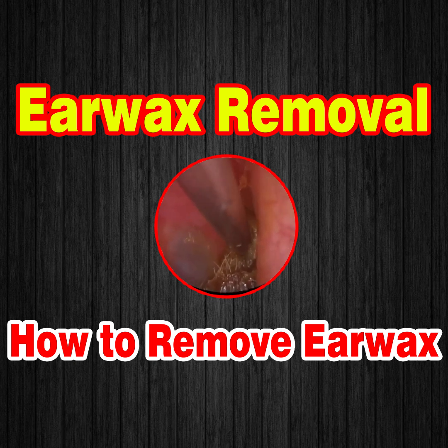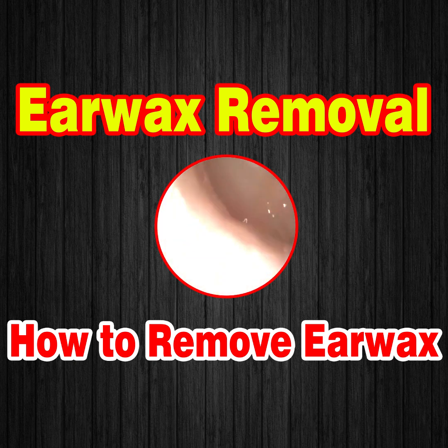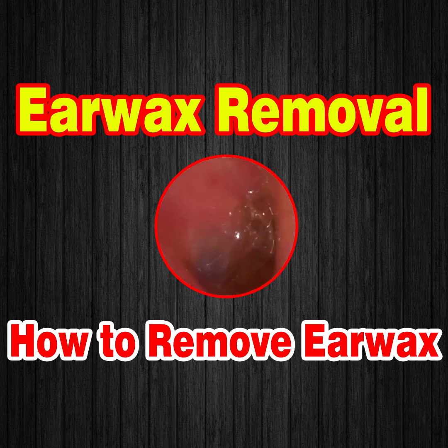So here we are with the endoscope, the iCLEARscope, and you can see this is the beauty of the endoscope. This is the wide field of view, and we can position the endoscope on the back part of the ear canal to the left and then rotate it towards the anterior recess, and you can see we've got a full visual here. There's a lot of olive oil because it's really stuck, it's sticky. Now I probably would have managed to get it out with the WAXscope, but of course I just felt at this stage it'd be better just to revert to the iCLEARscope just to get better optics.